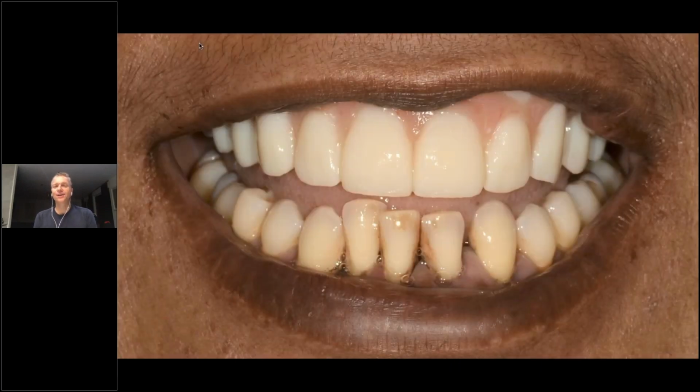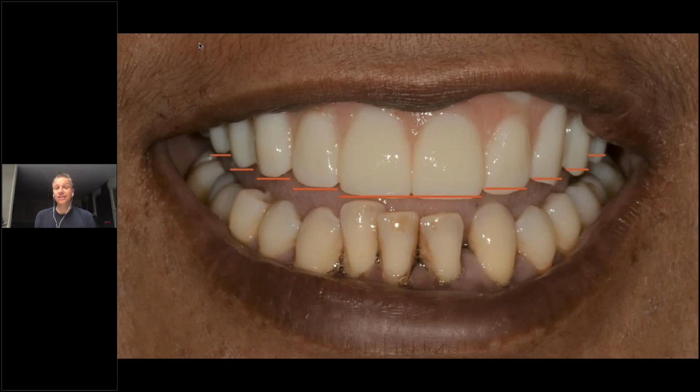And you see the temporary, we did the maxilla first before we did the mandible. You see the maxilla is placed and her big smile. And then she said, yeah, it looks really cool, but I think we maybe have to make it a little bit smaller. My original teeth were not as big. And I agree, she wanted to have big teeth first, and that's the sweetness of doing a provisional or prototype, to be able now to actually go back and maybe make a second one after a few months before we do the final. So this here is basically now, after 4 months, we started with the definitive restoration.